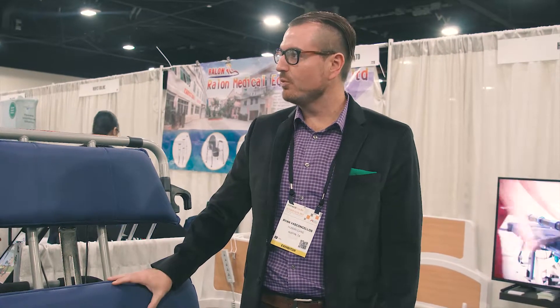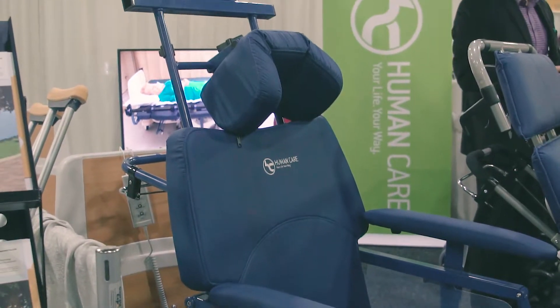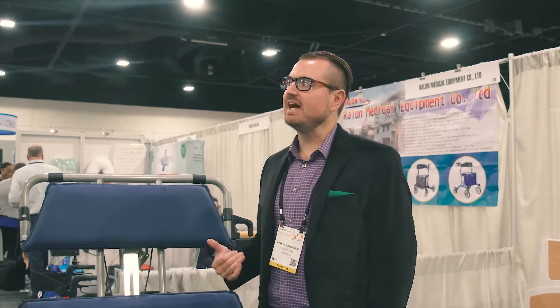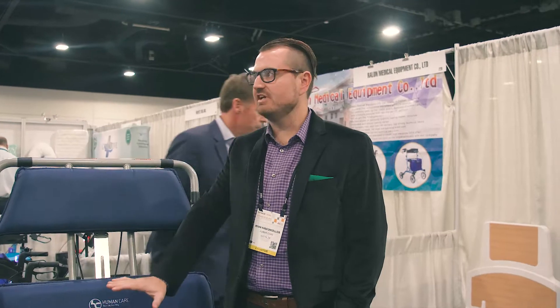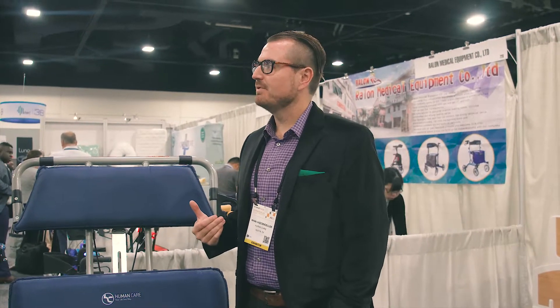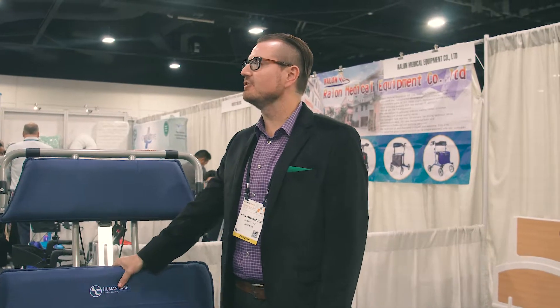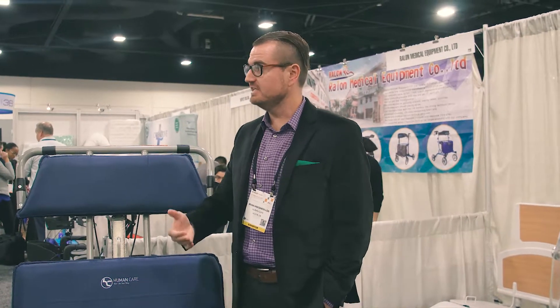This really allows you to transfer patients who are max-assist, unsafe for a Hoyer Lift, or for whom transfer is too painful. A lot of patients with wounds in their sacral and lower back area — every time they get transferred via Hoyer Lift, it rips that granulated skin tissue away. So this is a great chair for patients with wounds or prone to wounds. Anyone with a stage three or stage four wound is probably spending a lot of time on a specialty overlay, but once they start to heal, they can transition to the sitting surface, protecting the integrity of that granulated tissue. Patients still need to sit up so the diaphragm can do what it's supposed to do, and this chair provides both the offloading and the therapeutic material to make that possible.